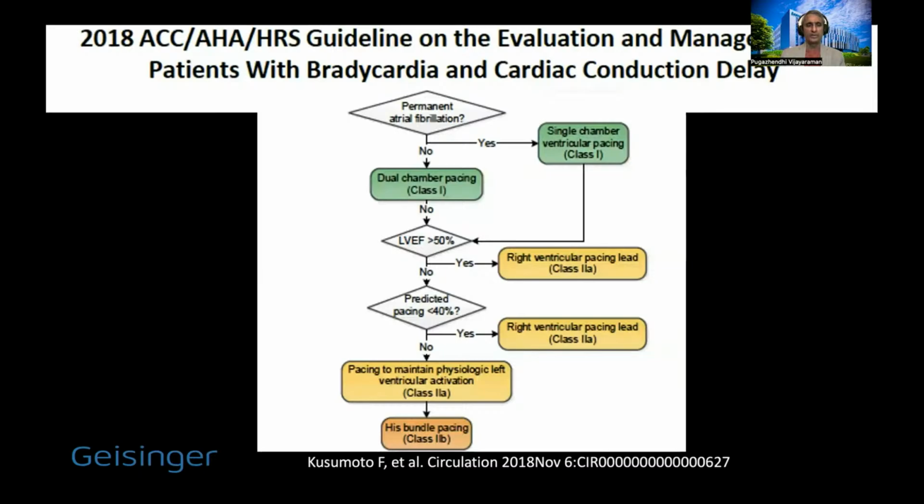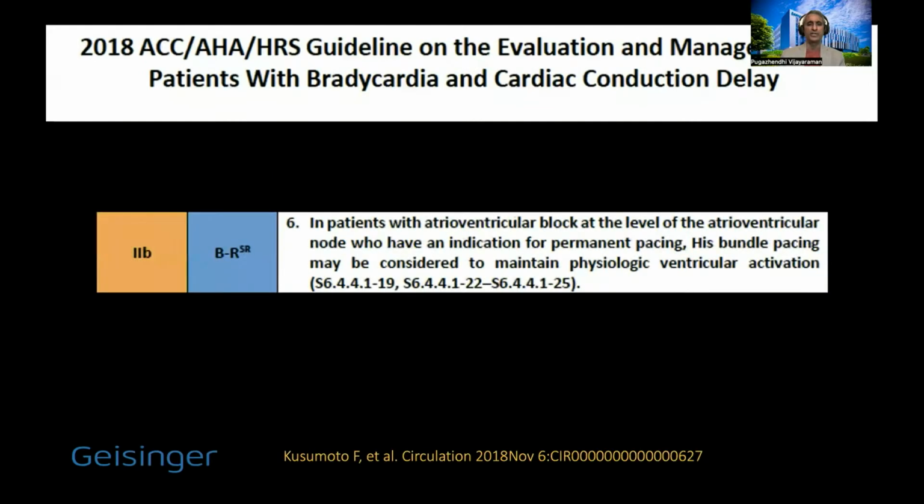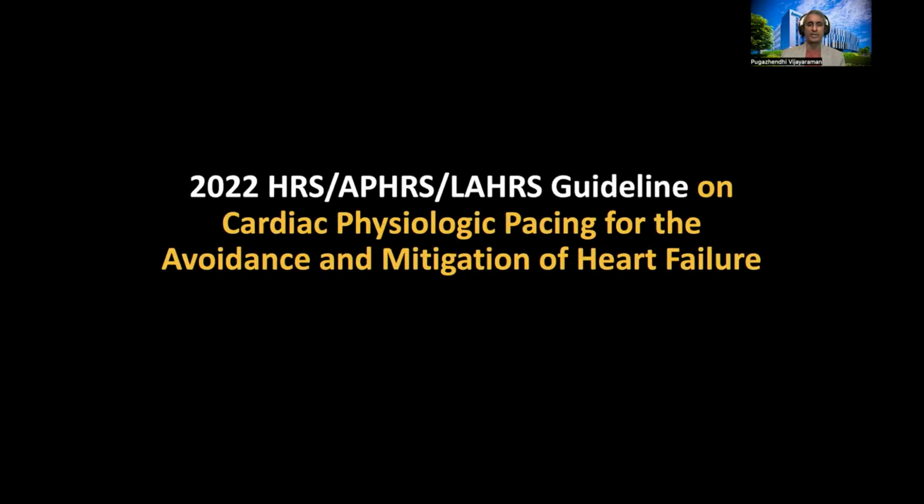Currently, our guidelines suggest a class 2A and 2B indication for His bundle pacing in certain clinical scenarios of reduced LV function, and ESC guidelines have given His bundle pacing in the setting of AV node ablation a class 1 recommendation.